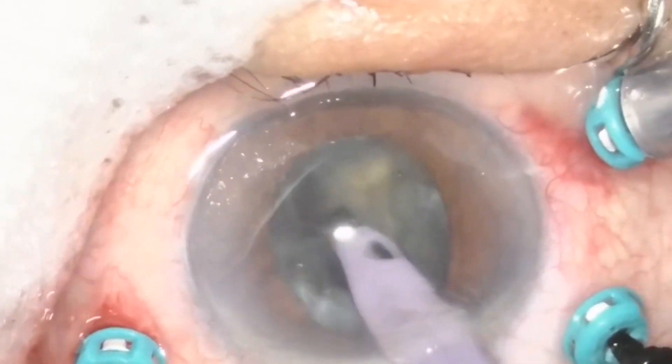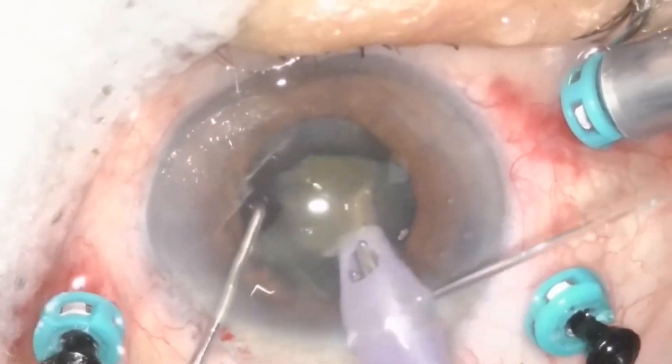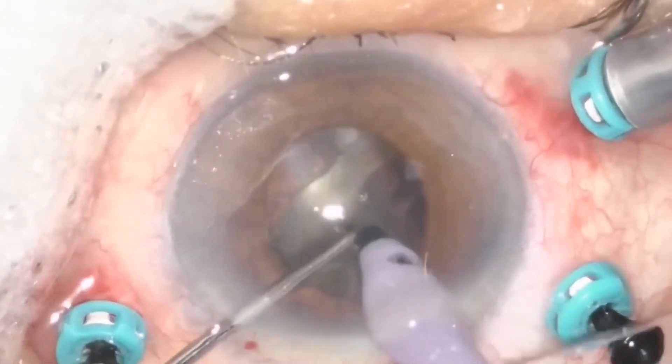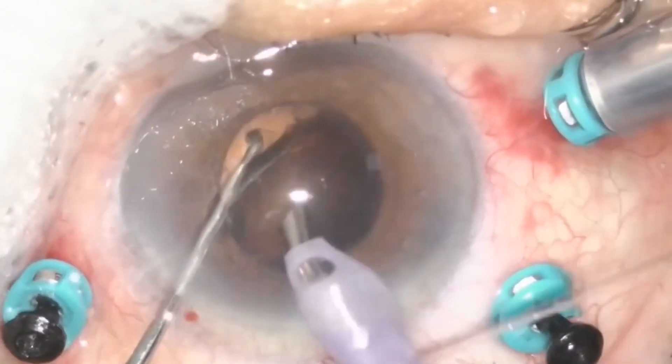Use the phaco handpiece to remove the nucleus. If possible, try not to break the nucleus into several pieces to avoid them dropping back into the vitreous cavity.